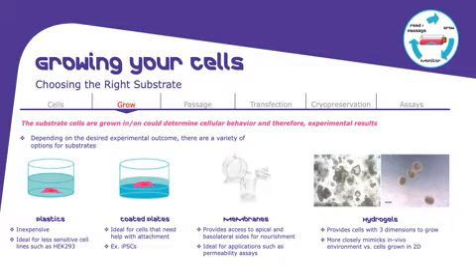There is also the possibility of growing the cells on membranes. As an example here, we have hanging inserts and standing inserts, and in that case cells are growing on the membrane and they receive the media from the bottom and from the top and grow almost like in a 3D environment.